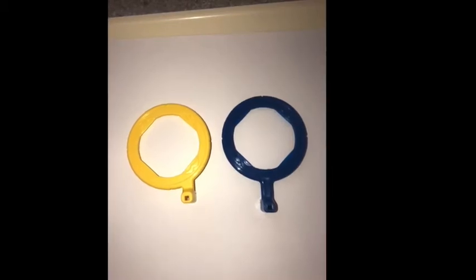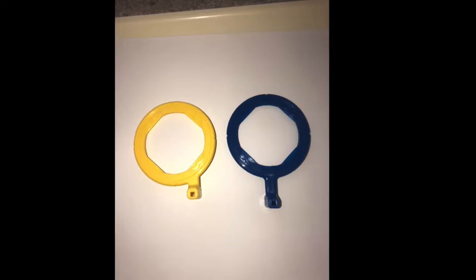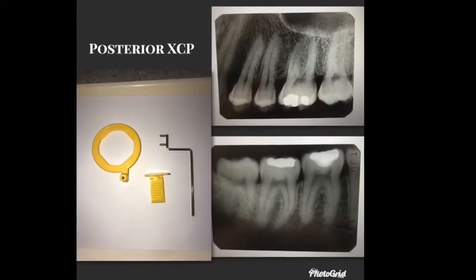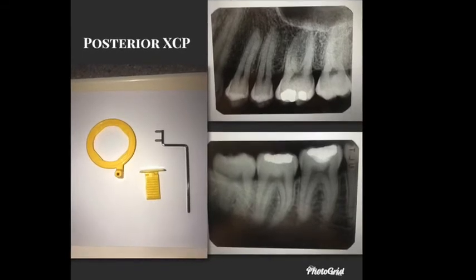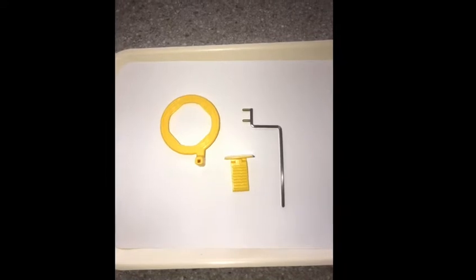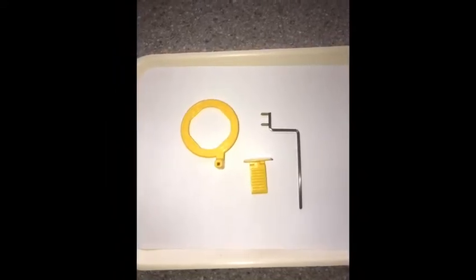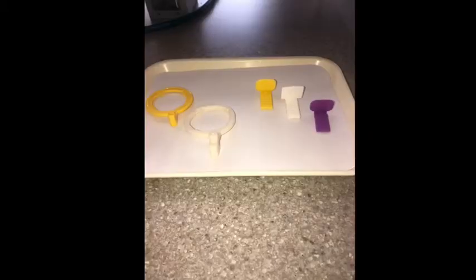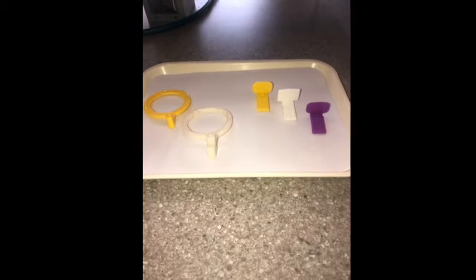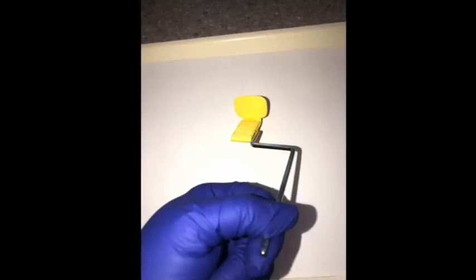There are two different rings: one for anterior and one for posterior. Here is the posterior periapical bite block ring and bar. It's used to take films to see the root end of the tooth. The rings and bite blocks do come in different colors, so don't get set on only the yellow or white ones.